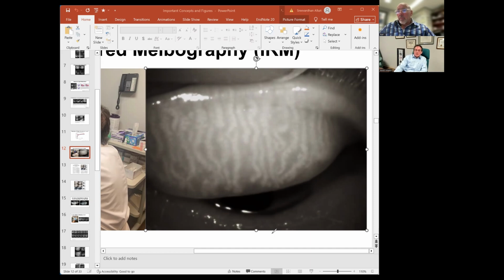But again, this patient has significant MGD, and meibography is helpful to identify structural change, both early and more advanced. Again, this is a frame from a video meibography. I like the video because it shows context. If I'm holding the lid in a way that changes the shape of the gland, that's not good. With a video I know if I've done that, and I can adjust my hold, whereas with a still shot you can't. You don't know if you've imparted undue pressure, creating an artifact.